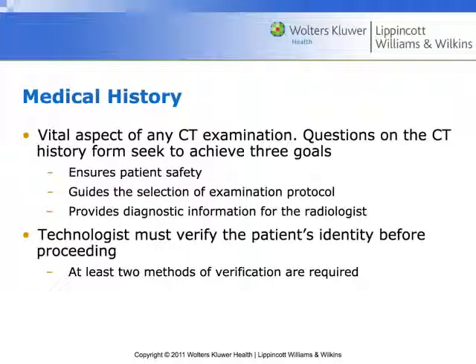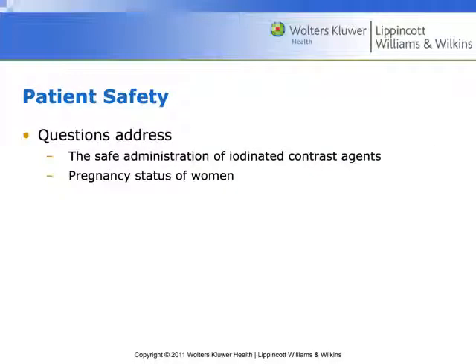I am never sure if this is the right exam until I'm locked in, I'm ready to go. Up until that point, I'm going to be checking the patient, getting history, talking to the physician if need be, making sure we're doing the right thing. You want to get at least two forms of verification for ID. I think we're all pretty good about doing that.